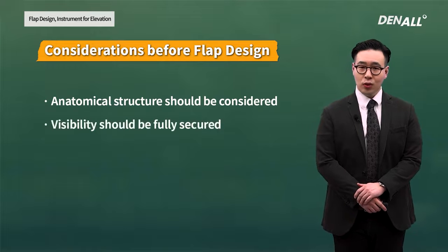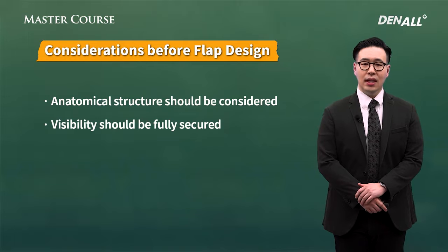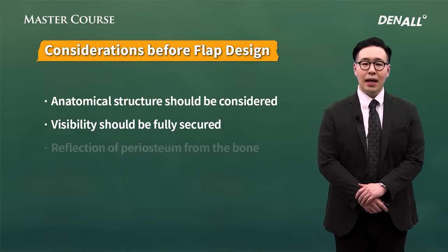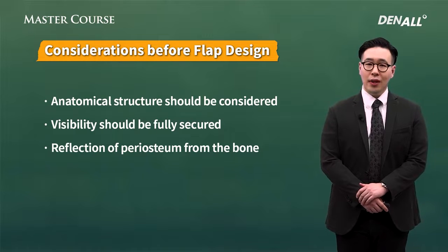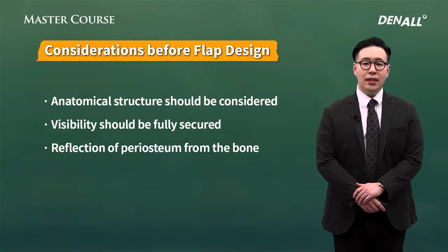Also, if you're a novice, you need to elevate flap sufficiently for visibility. Next, for implant placement, when you open flap, you need to reflect periosteum from the bone.